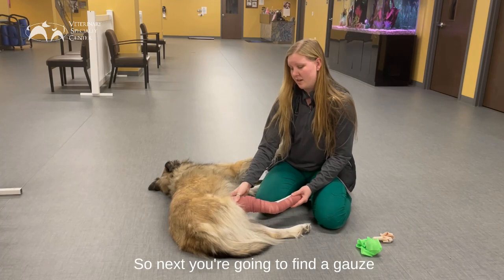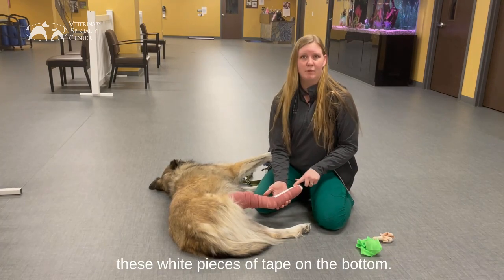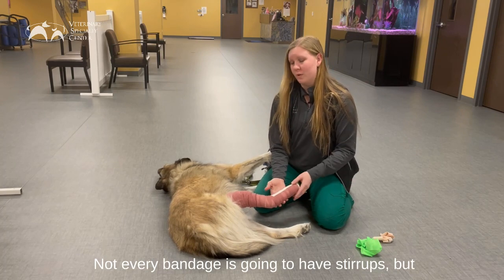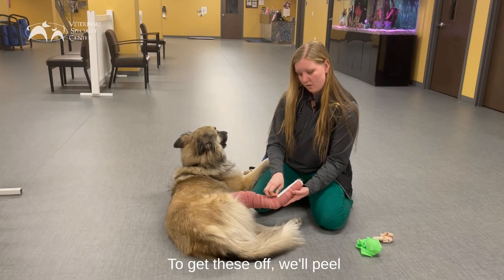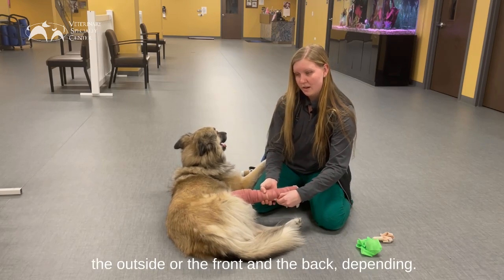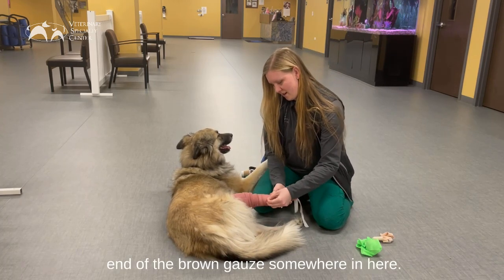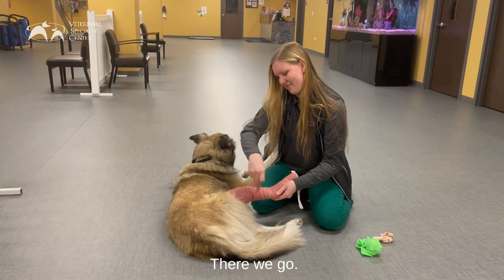Next you're going to find a gauze compressive layer, and some bandages are going to have these white pieces of tape on the bottom. We call these stirrups. They help keep the bandage upright rather than slouching down the leg. Not every bandage is going to have stirrups but if you do find some tape, that's normal. To get these off we'll peel the tape from the brown gauze — sometimes there's one on the inside and the outside, or the front and the back depending. Then you'll be able to find the end of the brown gauze somewhere in there.